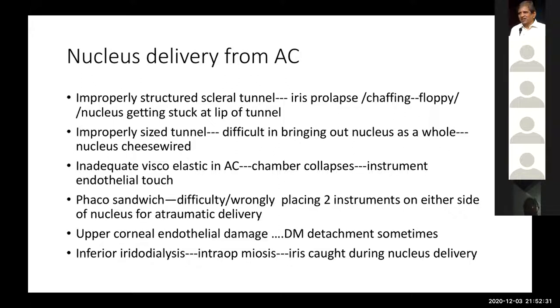And intraoperative miosis is another problem. Because of repeated maneuvering in the anterior chamber, the pupil usually tends to constrict. Basically, it is always better to put an NSAID preoperatively to keep the pupil well dilated, and intraoperatively to use adrenaline also. But even then, in many cases we see intraoperative miosis.